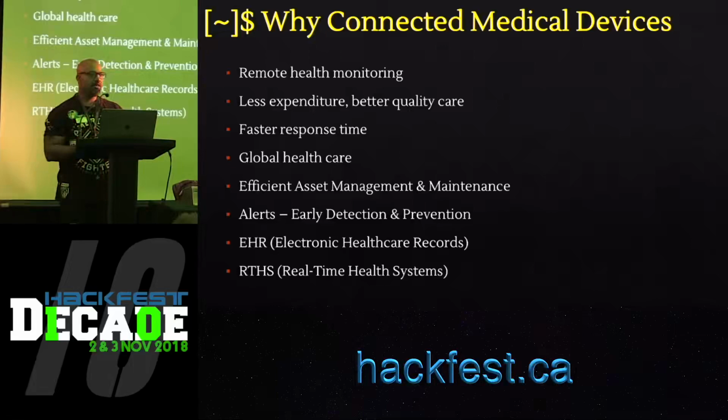So there have been a lot of horror stories or incidents associated with connected medical devices. I specifically wanted to talk about MedJack and MedJack 2 because they had the most impact. They were most noticeable among others. So MedJack, or medical device hijack, was a malware that came out in 2015 and lived through 2016. MedJack 2 is basically a more evolved and sophisticated version of MedJack. It came out in 2017.